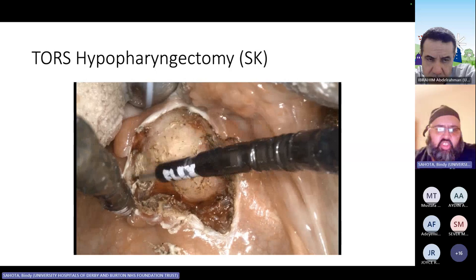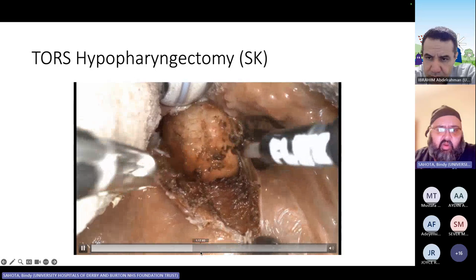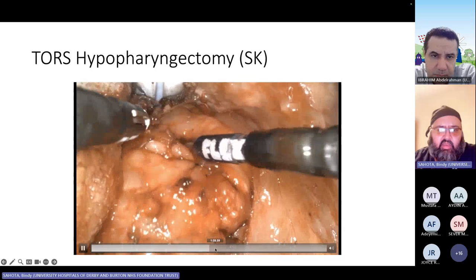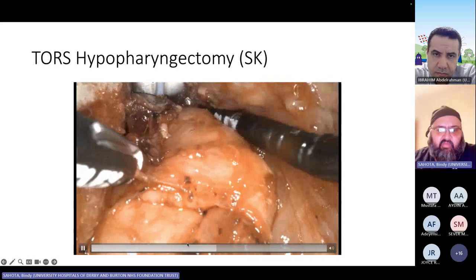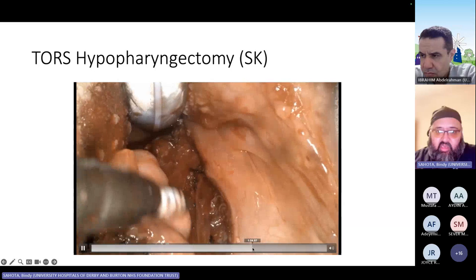And you can see here there's mobilization off from the top where it's taken off the pharynx. You want to keep it separate, obviously, from the great vessels, which are going to be right under the stylopharyngeus. And here it's coming down from the bottom, and it'll all be delivered in a second. You can't get a 4-centimeter margin as you should do with sarcoma with minimally invasive surgery in this area, primarily due to the proximity of the carotid. Overall, you can see this tumour has been chased way down to the hypopharynx there.